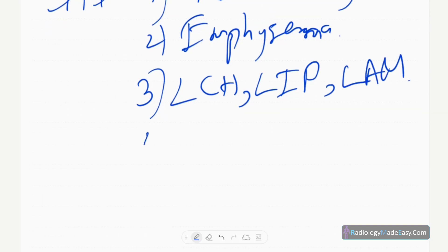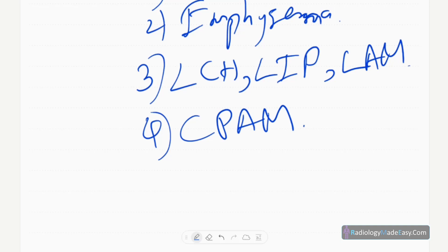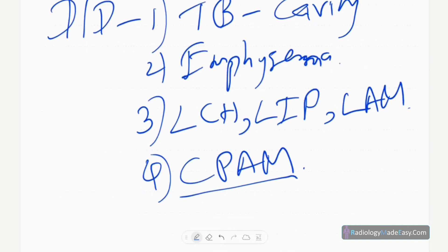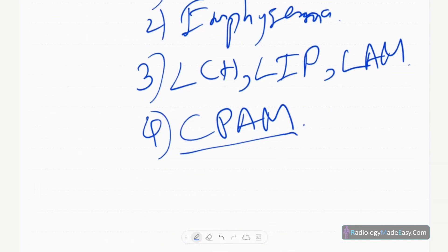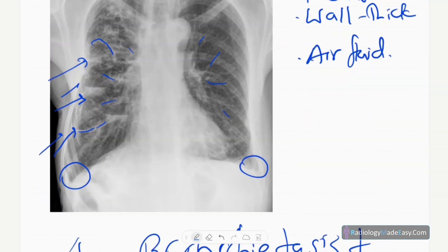In children, you have to think of congenital pulmonary airway malformation, or CPAM. It's important to consider CPAM in children when there are multiple rounded lucencies on imaging.